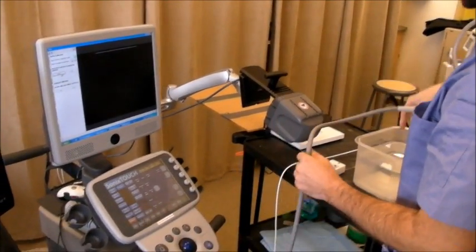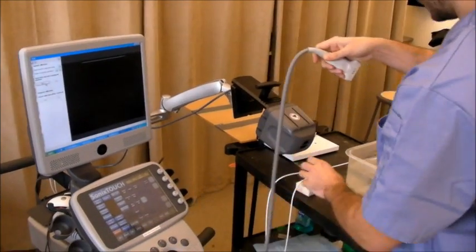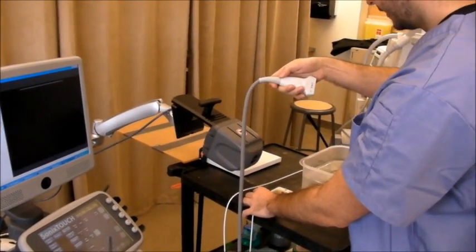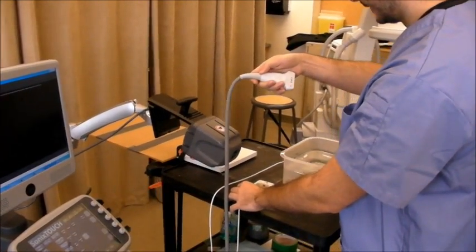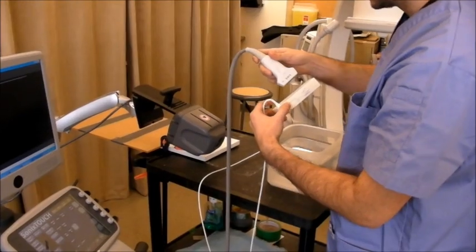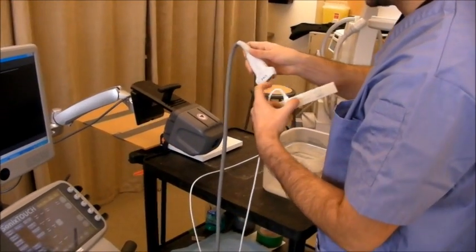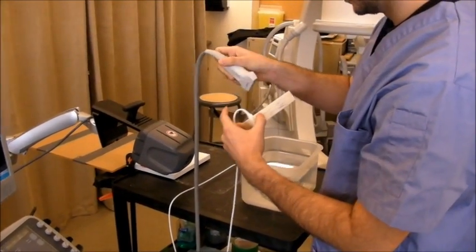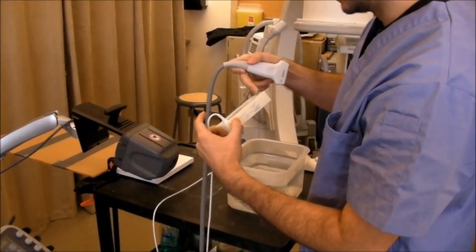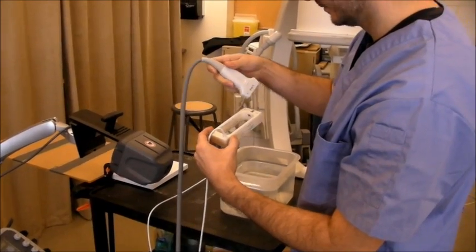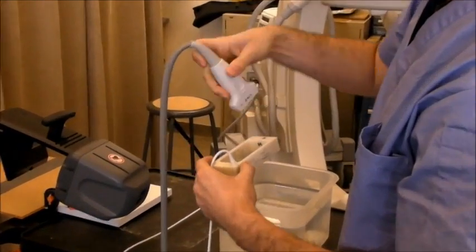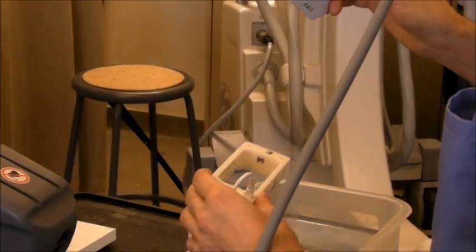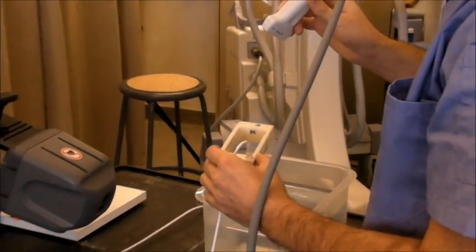We're going to use a bucket of water and the Phantom, and we have to make sure that the mark on the probe is at the marked side of the Phantom, because then the whole calibration would be invalid.